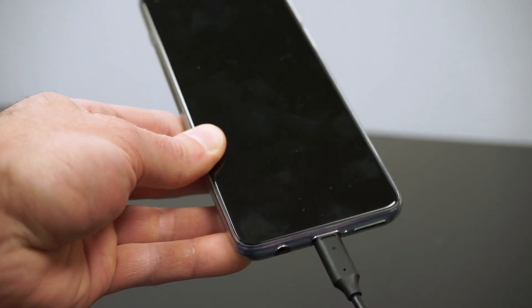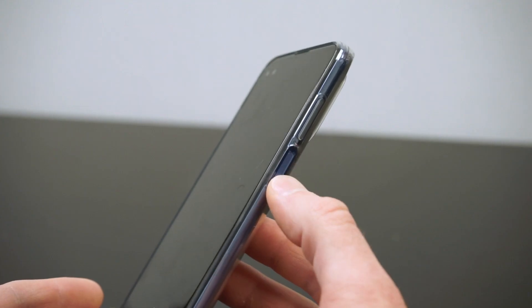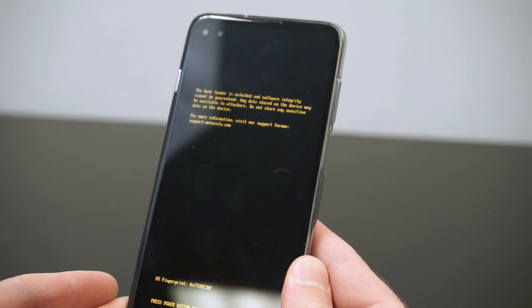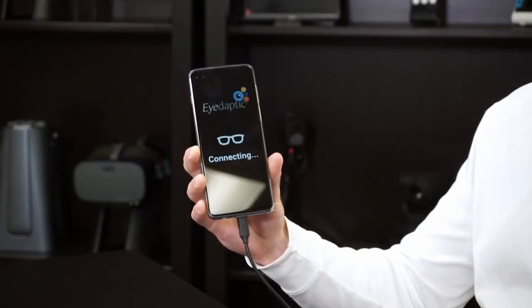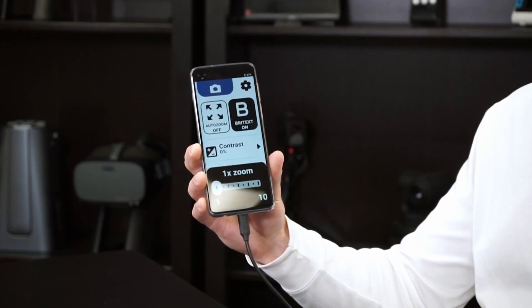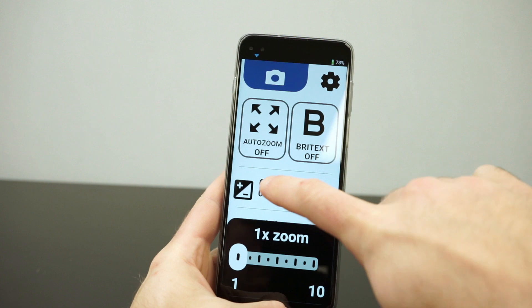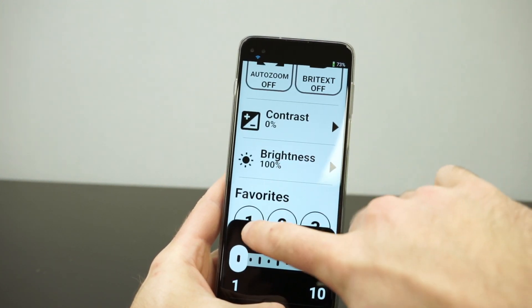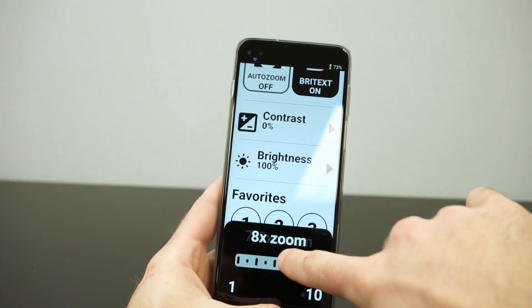You plug it into the phone and then power on the phone using this indented button on the right side of the device. Once I tap on this large icon, it will bring us into the iDaptic i6 platform. We see there are a bunch of different options, but the main thing we need to know is this slider at the bottom, which is going to change our magnification.